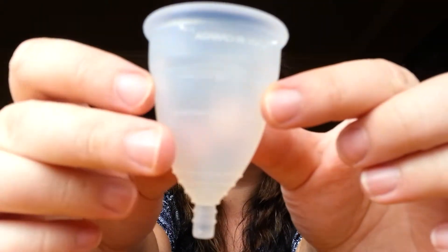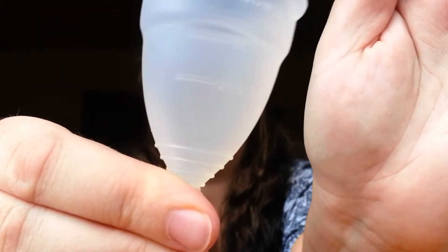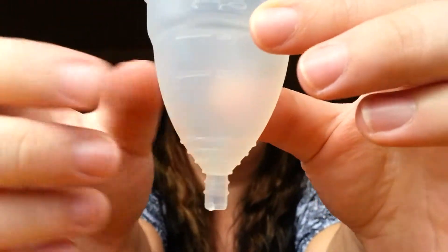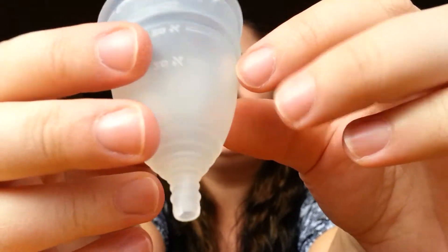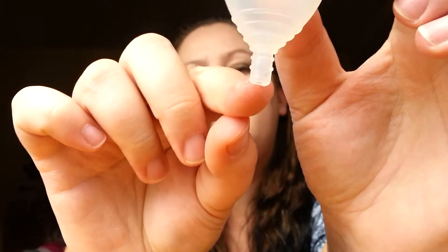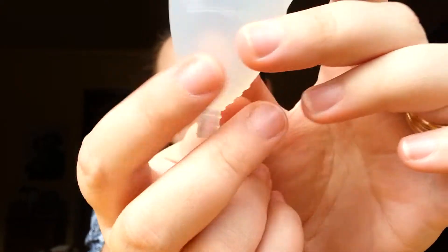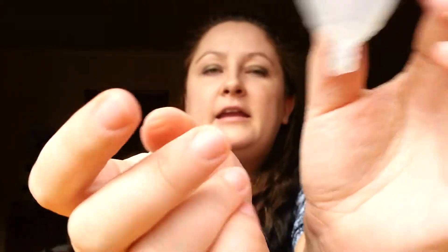Here's the cup — I'm going to show it up closer so hopefully you can see it. It has marks on the inside for milliliters and ounces, just to measure how much flow you've had. It also has a little pointy tip right here — you can cut it if it's too long for you, but I didn't feel like I had to.